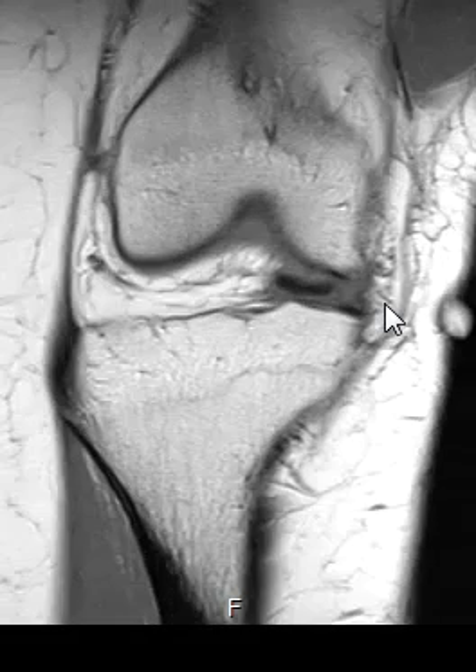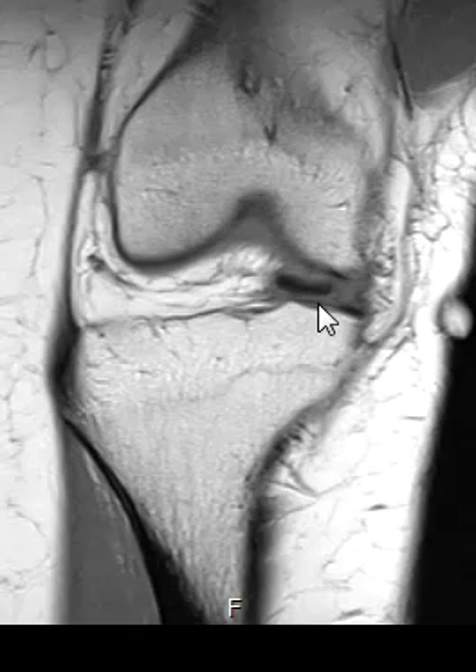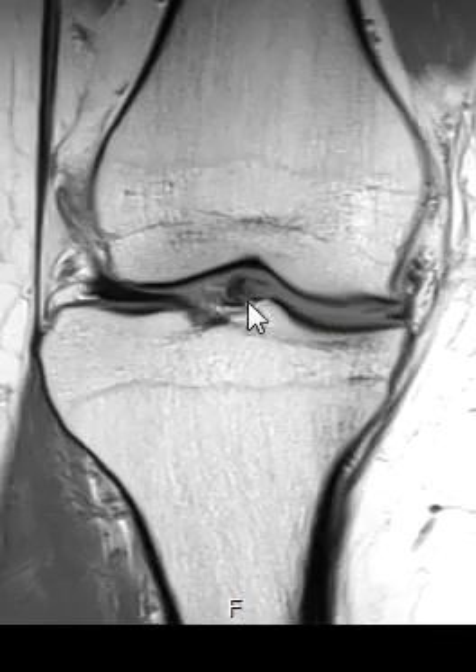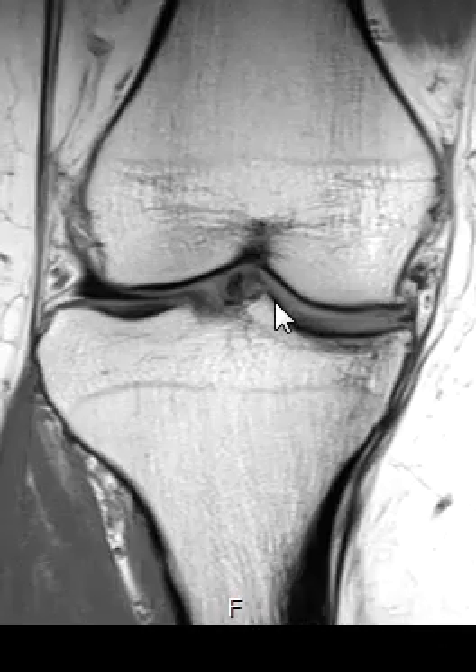So what happened to that meniscus? You can see it right here. On this view you can see this little band — that's the meniscus. It's flipped off; the inner part has torn and it's flipped into the central knee joint. There it is, you can see it coming across. This is what they call a bucket handle tear.